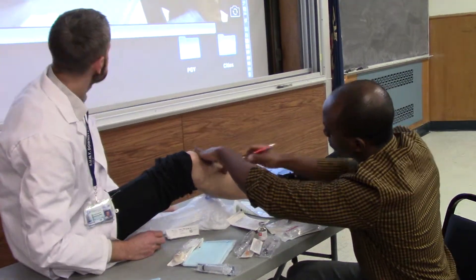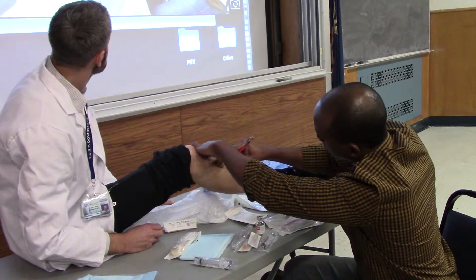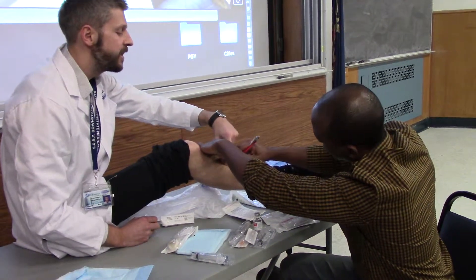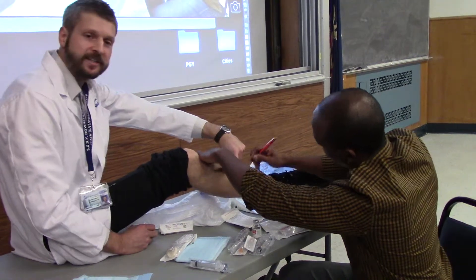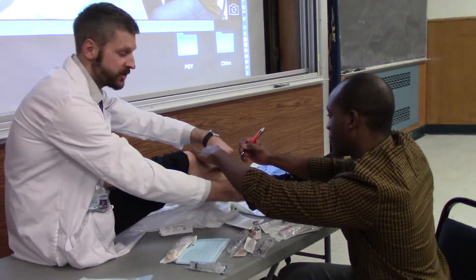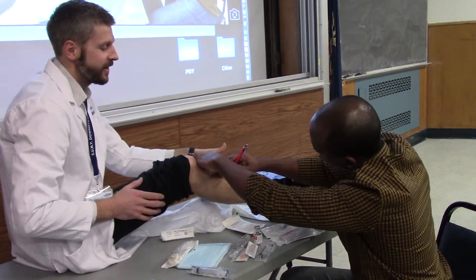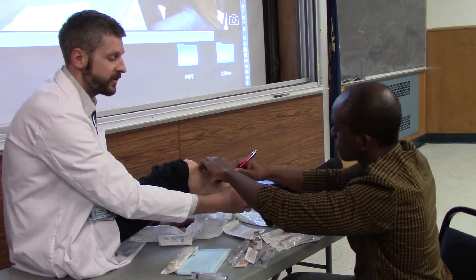Yeah, you can just trace that down. You're really just palpating the tibia. So you're feeling this and you're going straight down, because that's going to help you find out where your anterior compartment is, like off the side, and then most of your lateral — the most high-yield ones, if you're talking about the anterior compartment.